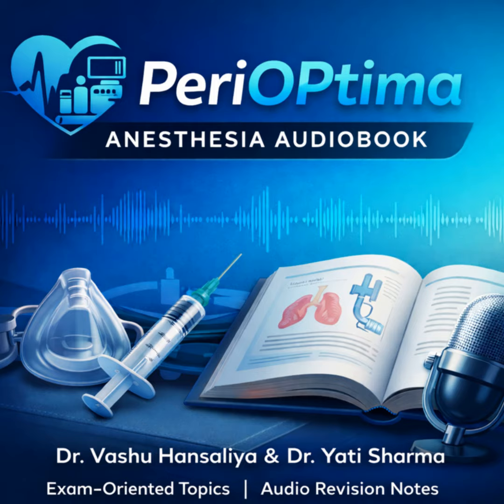You have these special crystals, like quartz, in the probe. You hit them with an electric current, and they vibrate. They physically change shape and scream out sound waves. That's the transmission. Oh, okay. But then the echo comes back from the body, hits those same crystals, and makes them vibrate again. And that vibration turns back into electricity, which the machine then turns into a dot on the screen.